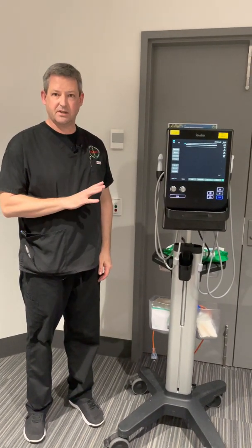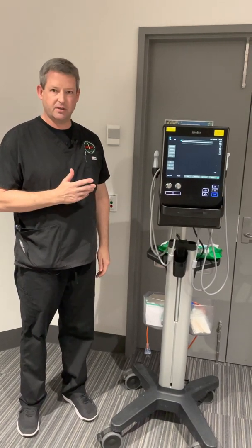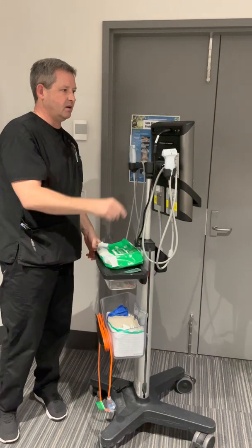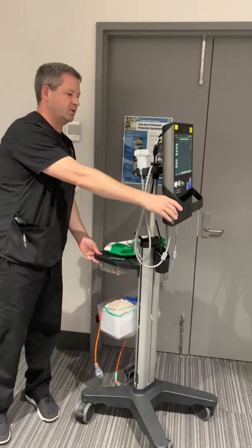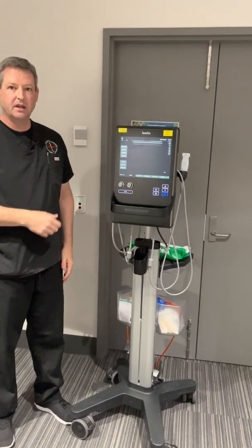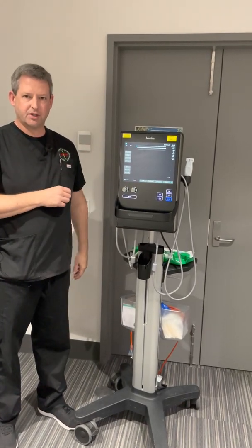I'm just going to talk you through the Sonosight S2, which is our procedures machine in the department, and some of the features that we use to work it. The on button is at the back of the machine, at which point the machine will boot reasonably quickly and give you this start-up screen. Sometimes there's a slight delay with a yellow message at the bottom that's just waiting for some of the function keys to become active.